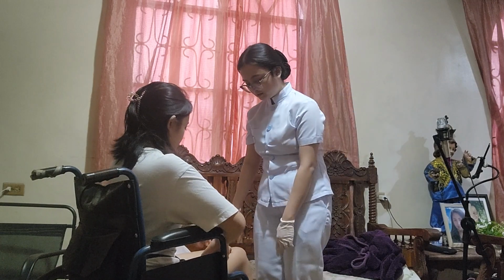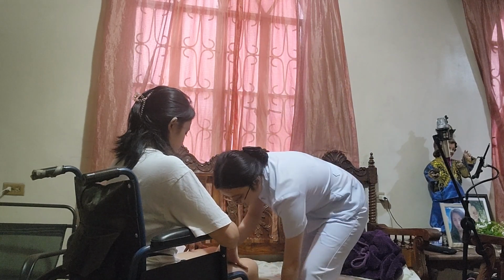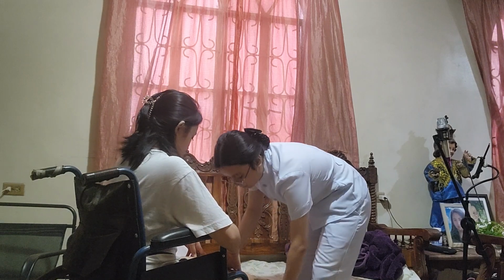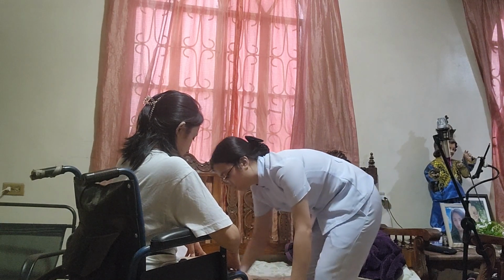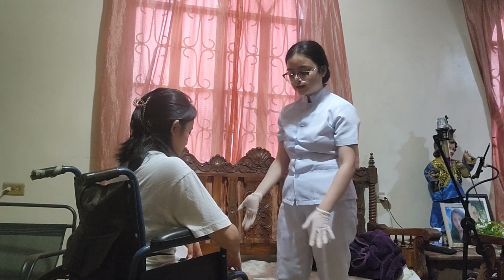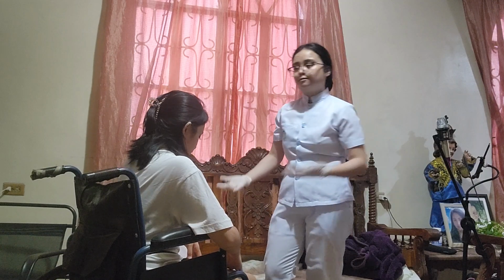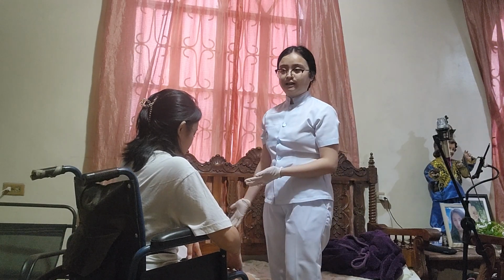Then, you will need to fold the footrest so that you can access or support the patient's legs when you transfer them to the bed.